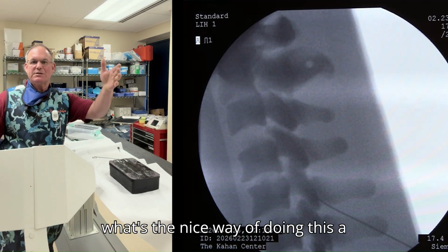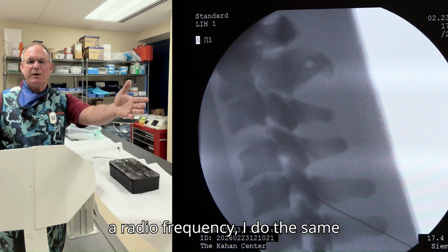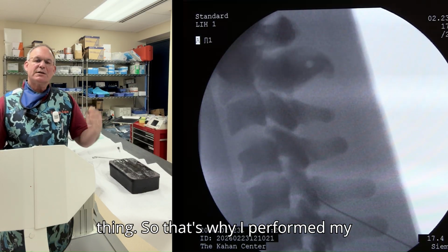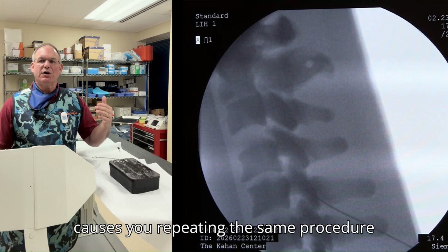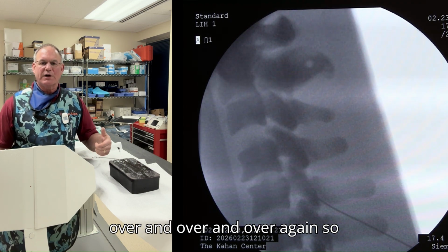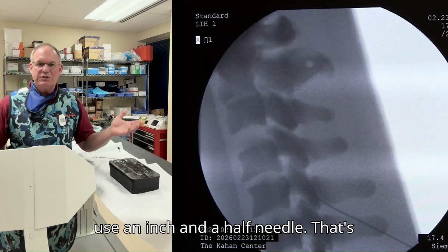Now, what's the nice way of doing this approach? Because if I wanted to do a radio frequency, I do the same thing. So that's why I perform my medial branch blocks as if I am doing a radio frequency. It constantly causes you repeating the same procedure over and over and over again, so you get more and more experience. Yeah, you can go from a lateral view and use an 1.5-inch needle.